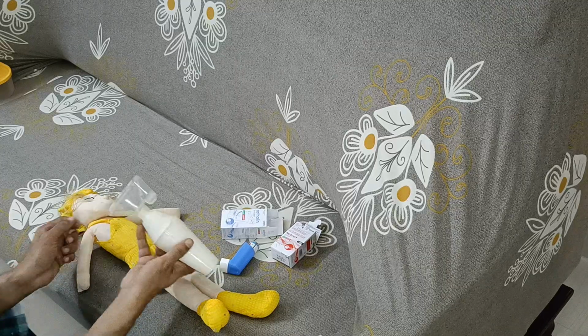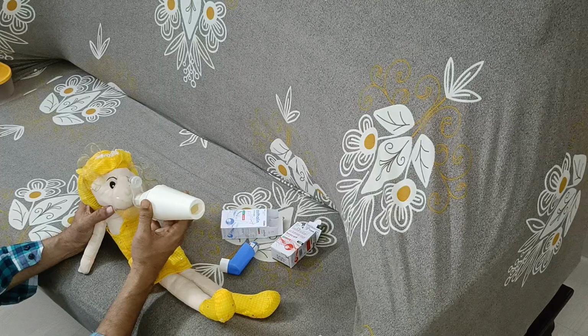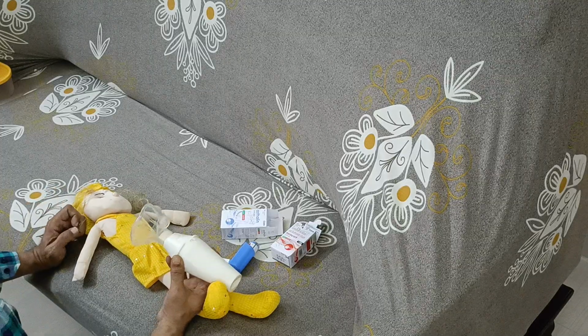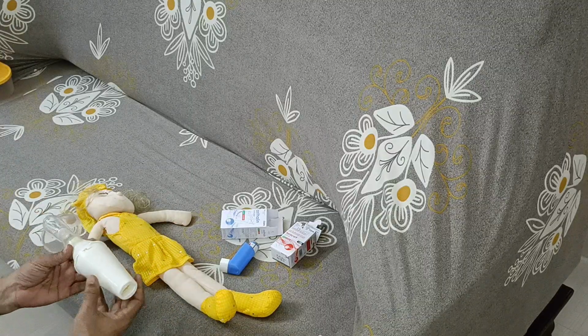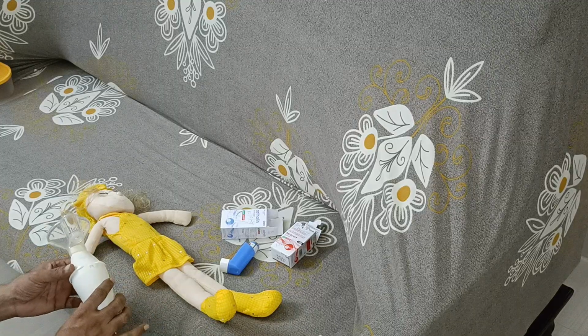So what is going to happen is, if I take this scenario into consideration, look over here, this is the way you are going to attach the mask and the spacer. Initially, you have to explain the mask as well as the spacer to the patient and the parents. You will be getting parents over there, so you have to explain to them how you are going to do the procedure.